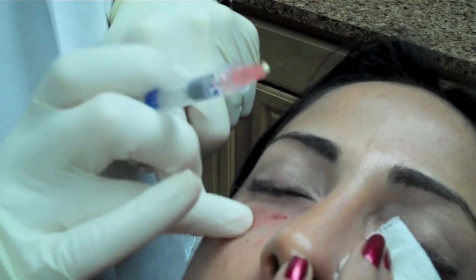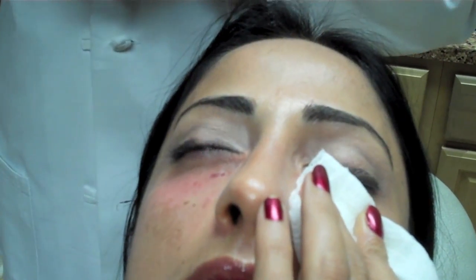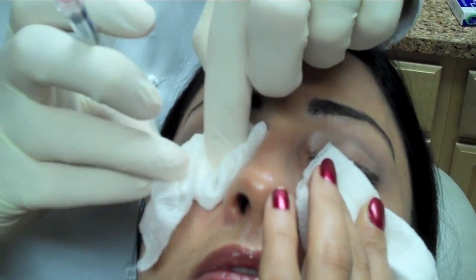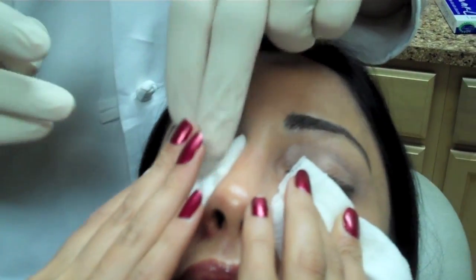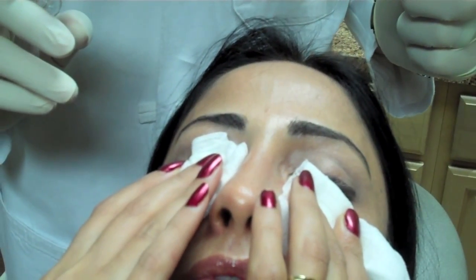Did okay? Mm-hmm. Now it's all nice and numb. The nerve that comes out is sensitive, but the rest of it is very numb. Okay. Almost done. And the nice thing about the injections to this area is that it lasts almost a year, sometimes even longer, as opposed to the lips, for example, that last about 4 to 6 months. Okay, I'm going to have you sit up again for a second.